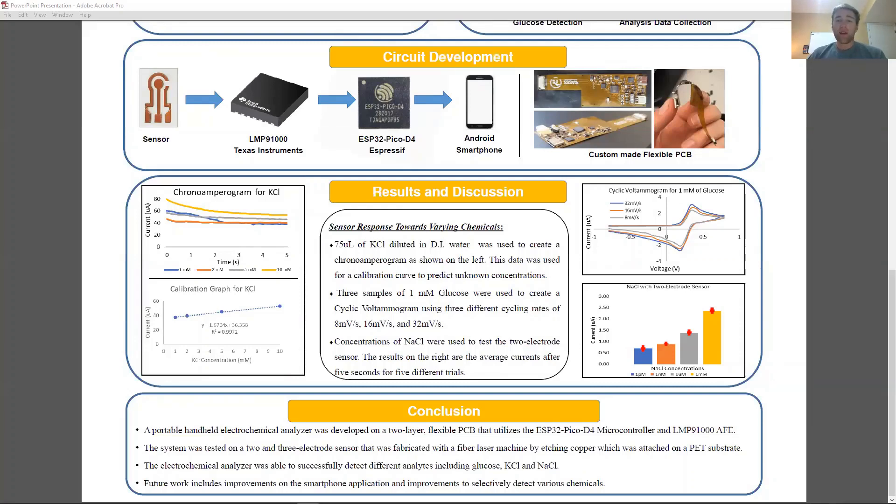The graph on the top left shows the results of the chrono-amperometry tests for potassium chloride diluted with DI water. Samples of 1, 2, 5, and 10 millimoles were used, and the results were used to make the linear calibration curve shown on the bottom left, with a coefficient of determination equal to 0.9972. The graph on the top right shows the cyclic voltammetry results of a 1 millimole of glucose diluted in DI water.